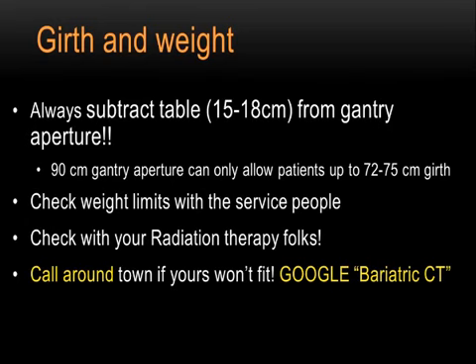And Diana actually gave me a wonderful trick. She said one of the things that she likes to do is Google bariatric CT. Just to make sure, if there is a case and she cannot put it on her own scanner, just Google bariatric CT and you may be able to find a scanner that will be able to take bigger patients. Another thing that I try is that often the radiation therapy folks have a much wider bore, because they have to put all the radiation shields and other devices over the patient. So they do tend to have a larger bore gantry. So it might be worth contacting them.